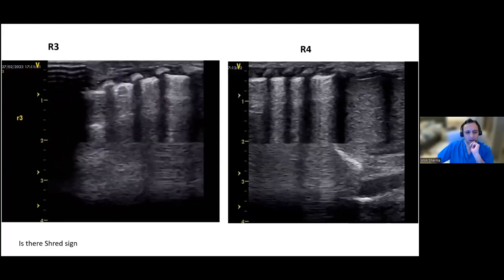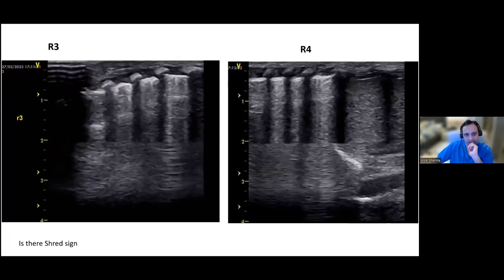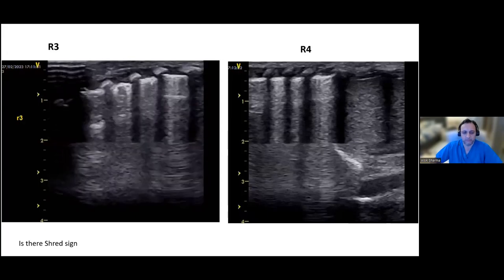So what I would suggest is trying to drop your frequency and playing with it. The only other thing you can do is, do you have an gain setting on your machine? Okay, no worries. Let's chat next week when you have some time to have a look at your machine. My only worry is you're losing out on the deeper artifact that will give you some information. Yes, the superficial bits are very, very well demarcated.